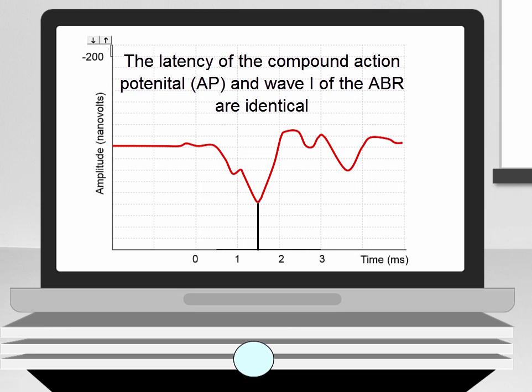If a clear wave 1 on the ABR cannot be recorded on a patient, then ECOG can be used to obtain the wave 1 latency. This can then be used to calculate the inter-peak latencies and the integrity of the neural pathway can be assessed.